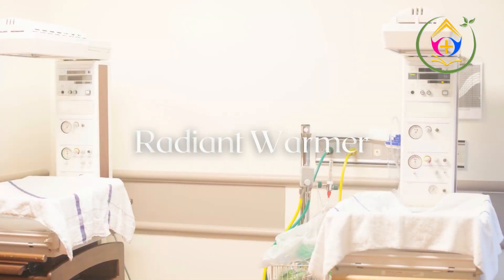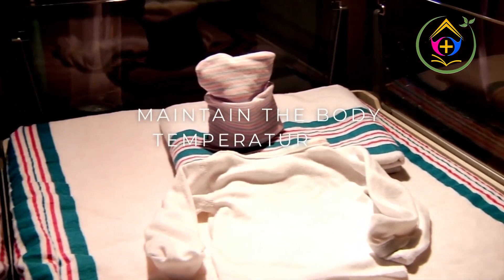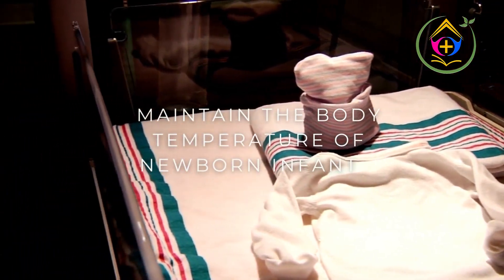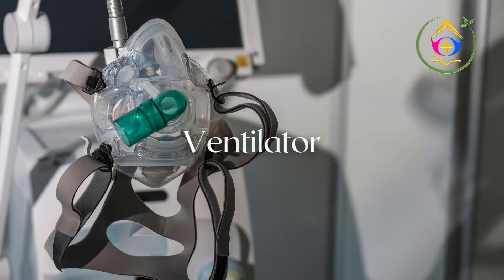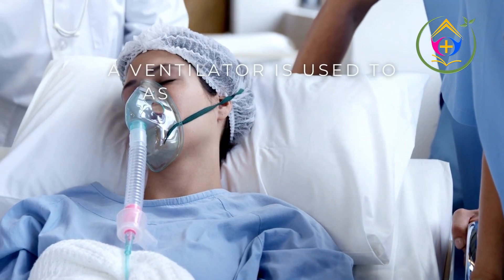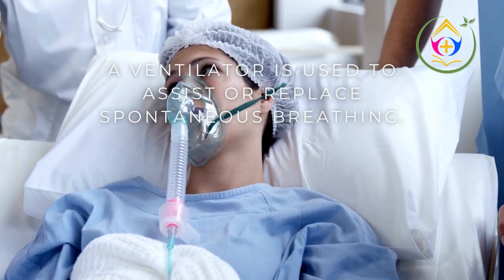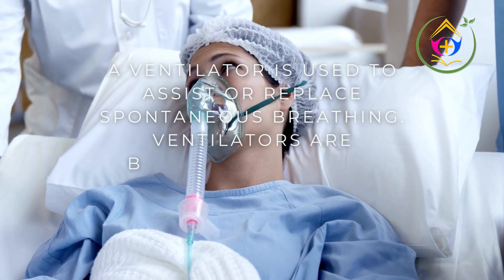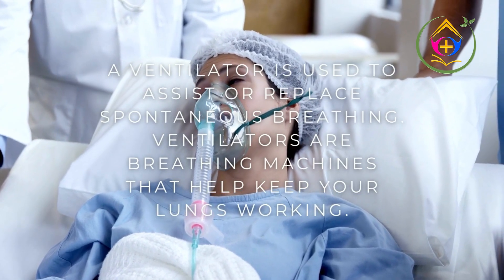Radiant Warmer: maintains the body temperature of newborn infants. Ventilator: used to assist or replace spontaneous breathing. Ventilators are breathing machines that help keep your lungs working.